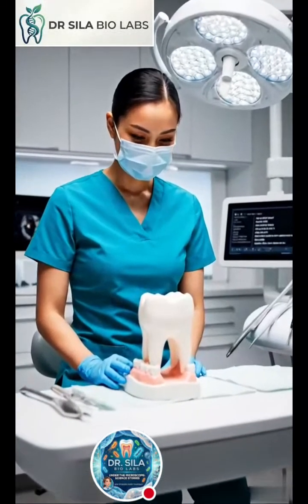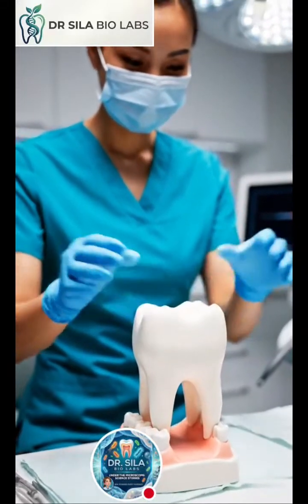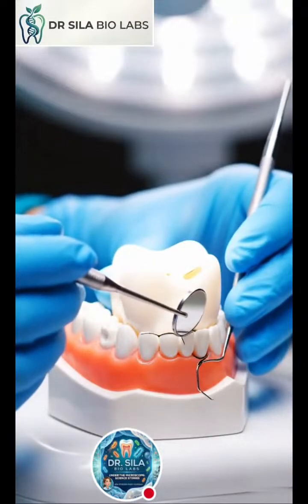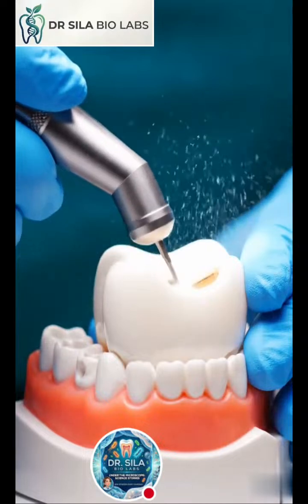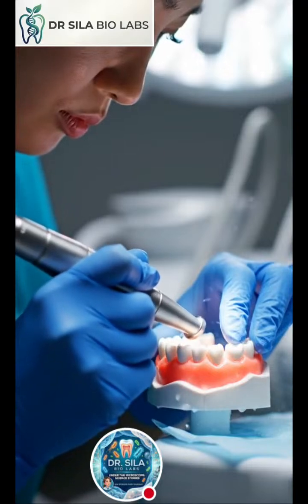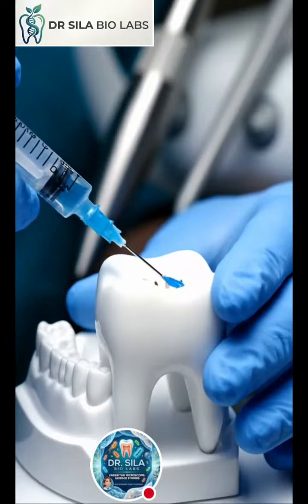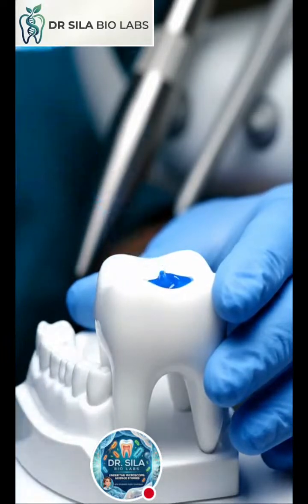This clinical demonstration shows a fiber post and core buildup procedure, which is performed on a badly broken or root canal tooth to structurally reinforce it before a protective dental crown can be placed. The procedure unfolds in these steps: preparing the canal, etching and priming. A blue dental etching gel is injected into the space to prepare the inner tooth walls.